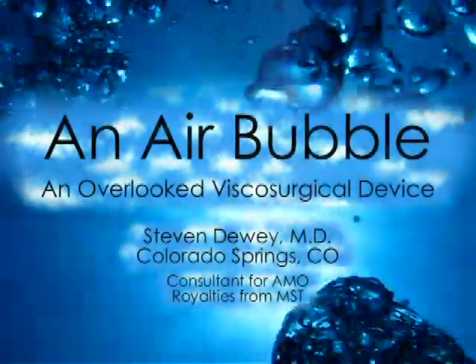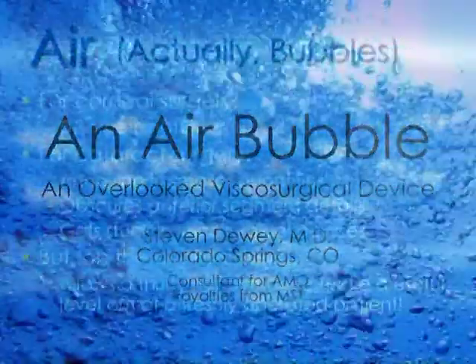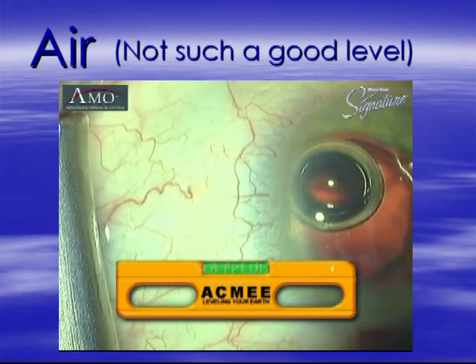An air bubble, an overlooked viscosurgical device. Steve Dewey, Colorado Springs, Colorado. Air, well, bubbles, are quite useful in helping position things inside the eye, especially in corneal surgery. But for cataract surgery, bubbles usually are annoying. They obscure details, get stuck in viscoelastics. But on the bright side, if we're paying attention, we can actually use a freshly operated patient as a level.